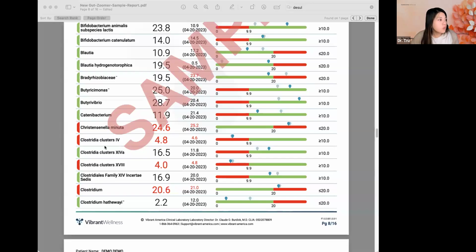Okay, so now we're going to go into these Clostridia bacteria. I'm just mentioning all the important groups first, okay? These guys represent 10 to about 50% or more of the microbiome. It is critical for intestinal lining health. It helps restrain or control inflammation, autoimmune disease, and it helps control harmful bacteria. It is also involved in metabolic regulation, so your metabolism, right? And they're important producers of butyrate and secondary bile acids.